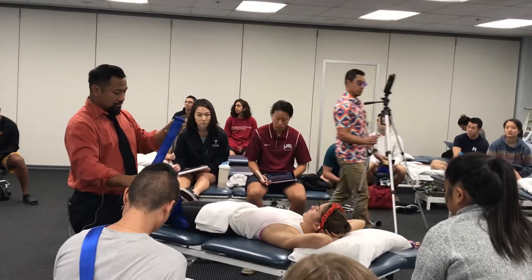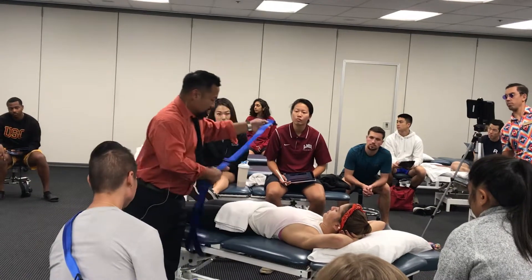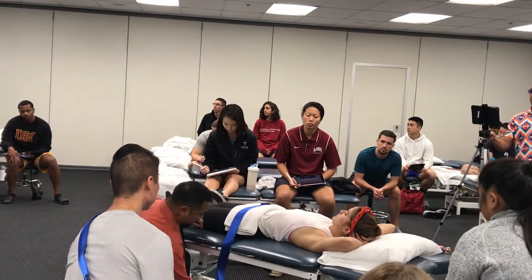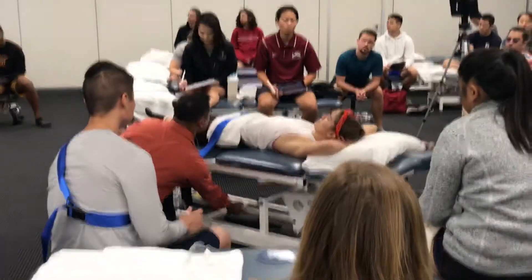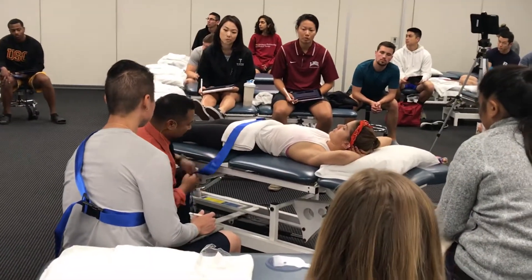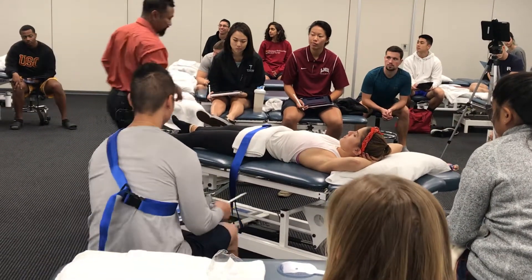The belt strap is going to go underneath her ASIS to create some sort of stability. The strap is going to go on top of the patient, loop down and under the table, but not underneath the bar that moves. That's going to crush the patient if I raise it up or down. So I want to make sure that this strap goes in that area where nothing moves.